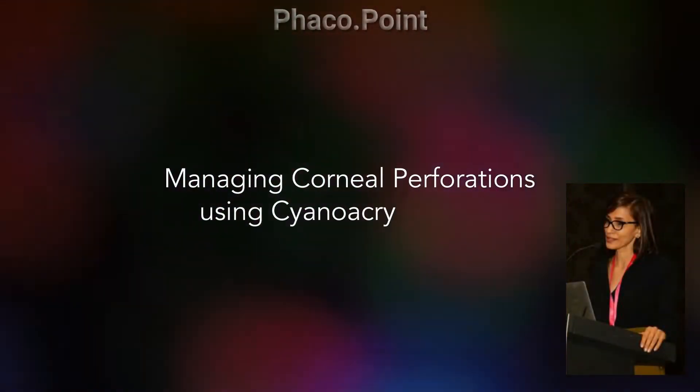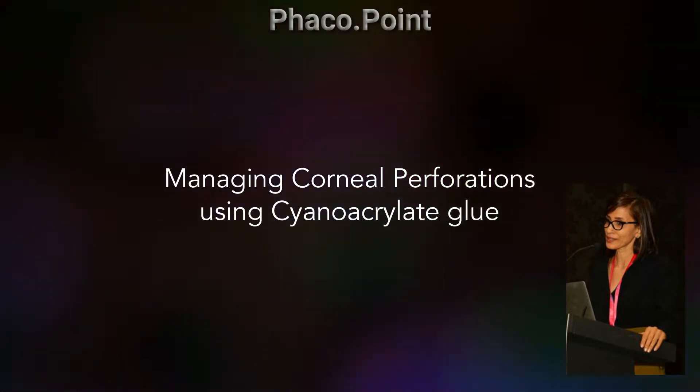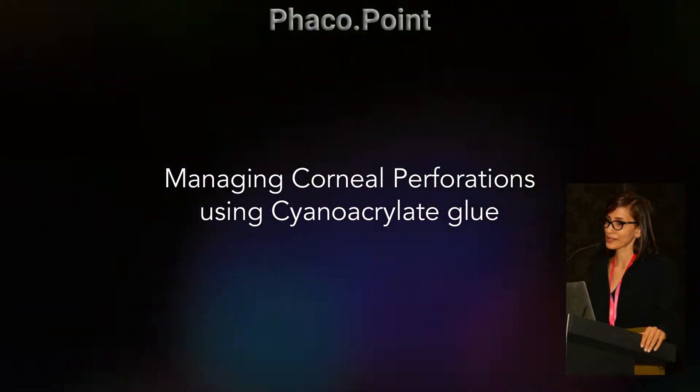This video will depict the exact technique of using cyanoacrylate glue to create a temporary seal in patients with localized corneal perforations.